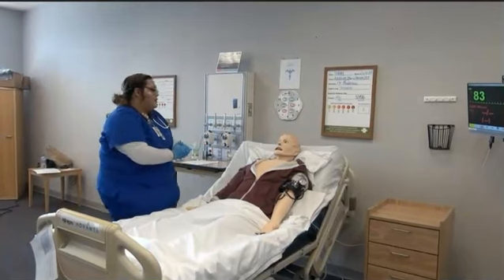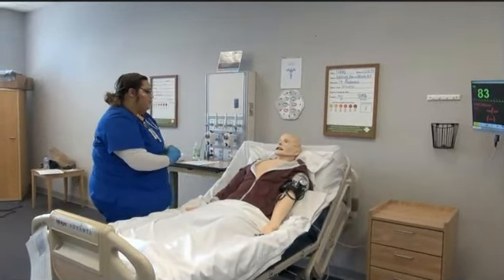Okay, I'm going to go ahead and assemble your breathing treatment, okay, sir?